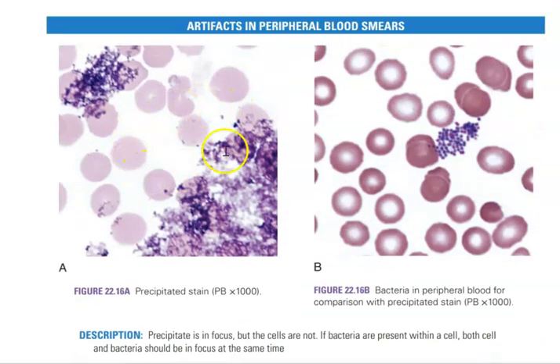So we use different stains, of course, to stain our blood smears. You can see your red blood cells here, but all this greenish-looking purple sediment is precipitant from your stain. This is coming from within your stain and is sitting on top of your cells. So this would be considered an artifact. This could be a result of the stain getting too old or close to the expiration date, or just the stain being dirty and needing to be changed out.